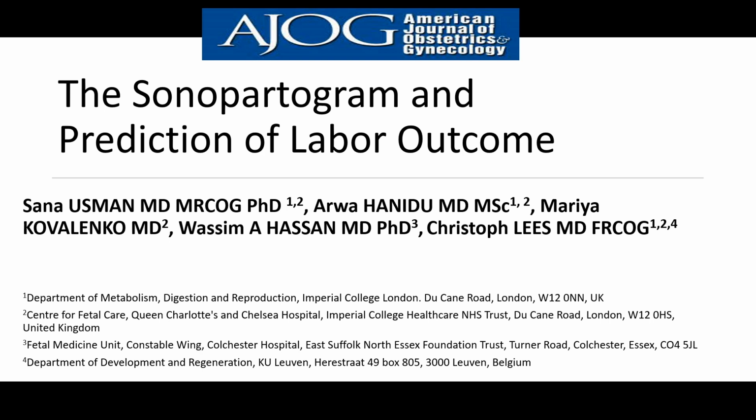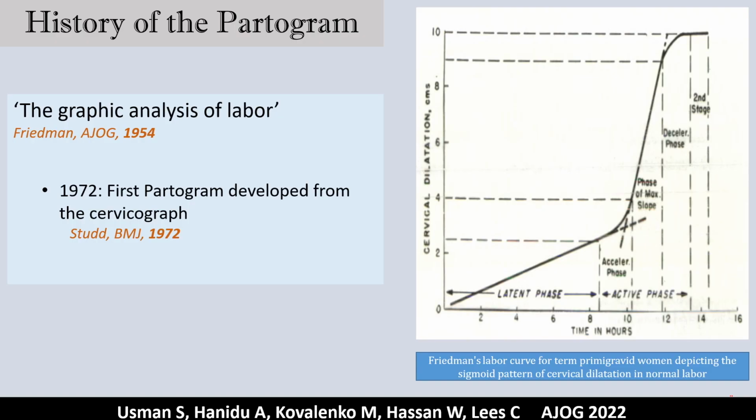An expert review of the Sonopartogram and the prediction of labor outcome. The Partogram history. Emanuel Friedman studied the progress of labor in the 1950s, originating a graphical representation of an ideal labor, defining its normal length and duration.